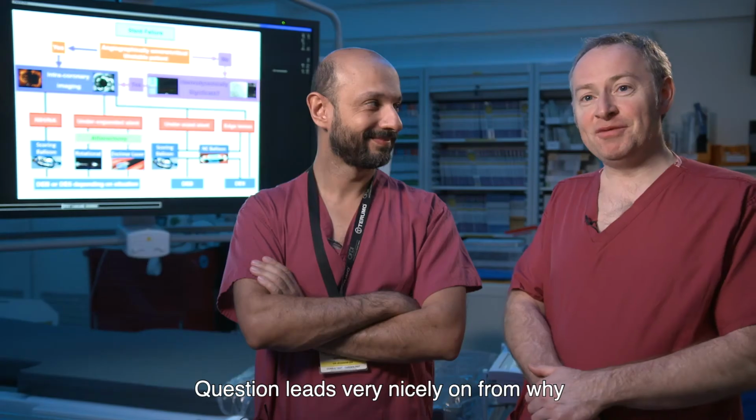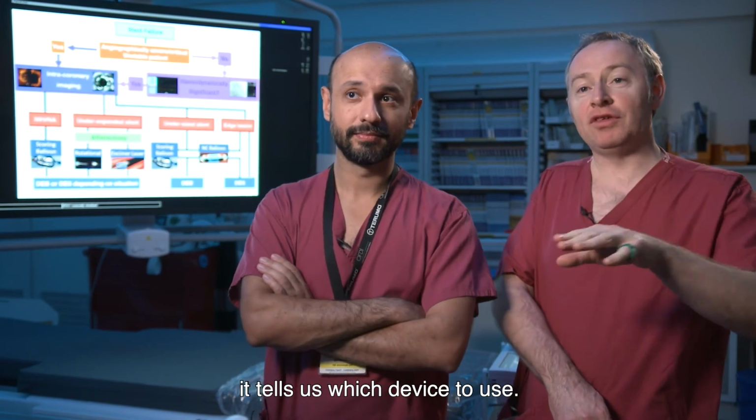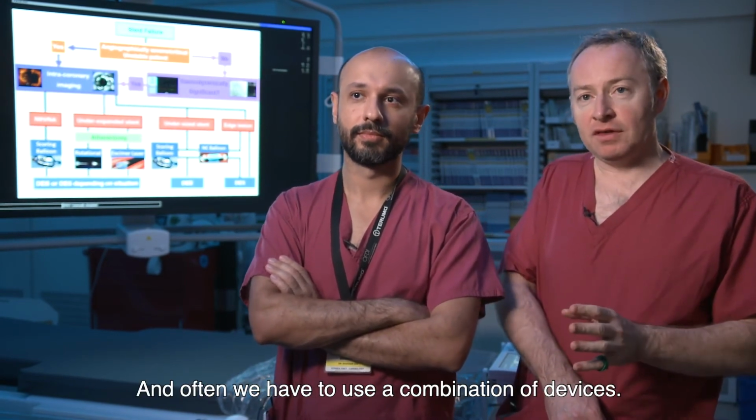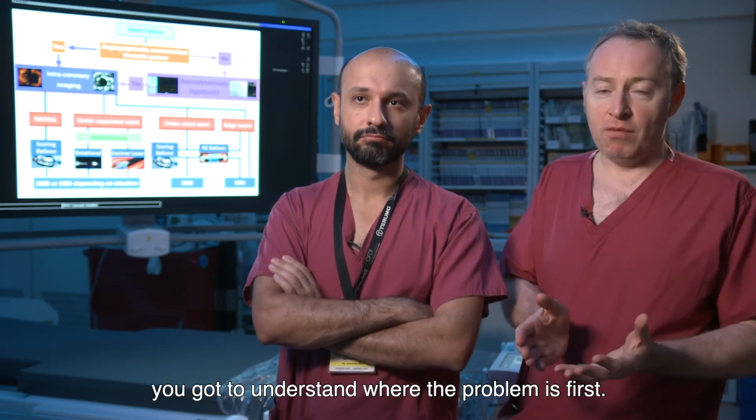This question leads very nicely on from why we use intracoronary imaging, because once again, going back to our algorithm, it tells us which device to use. And often we have to use a combination of devices. So lesion preparation is key; you've got to understand where the problem is first.